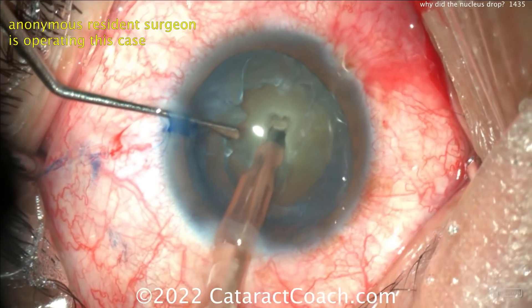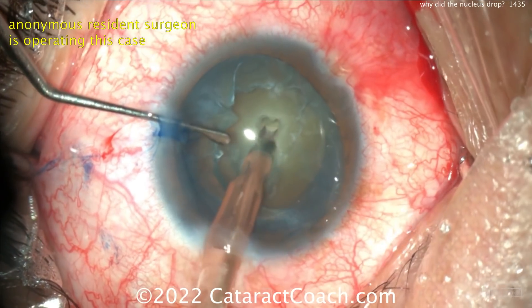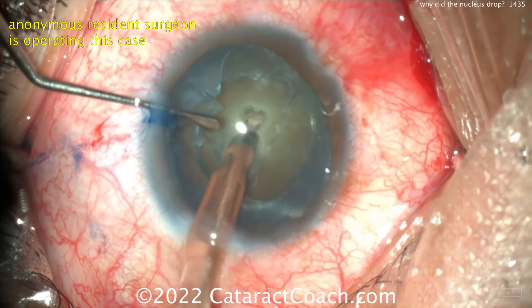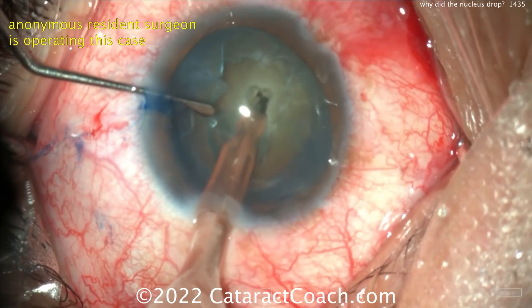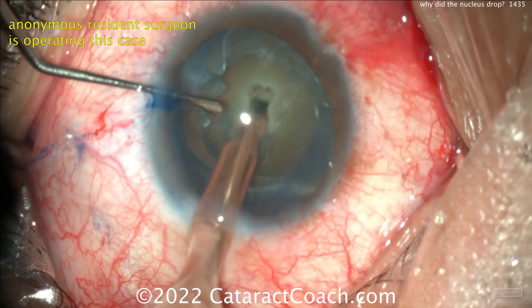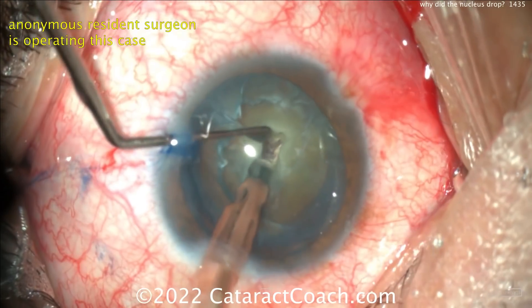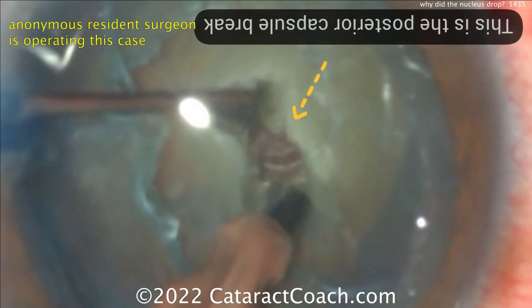We're going to get the nucleus up out of the bag. You've already violated the posterior capsule — why do you keep going in that one spot to make the posterior capsule defect even larger? No. I would convert to MSICS. Look at that full thickness groove — you have gone all the way through. That's the posterior capsule break.